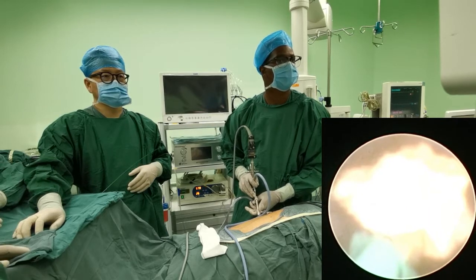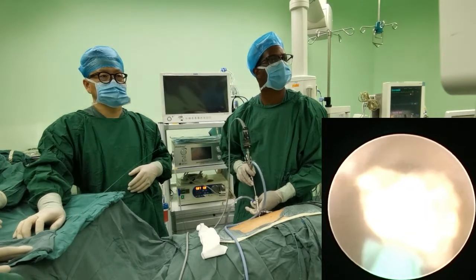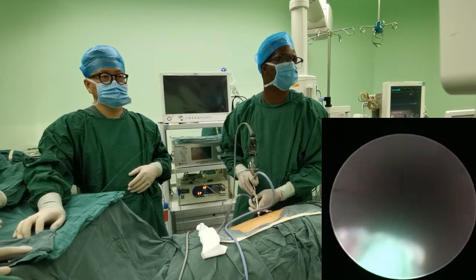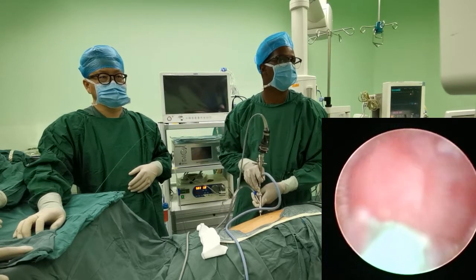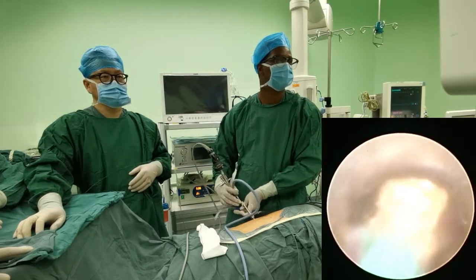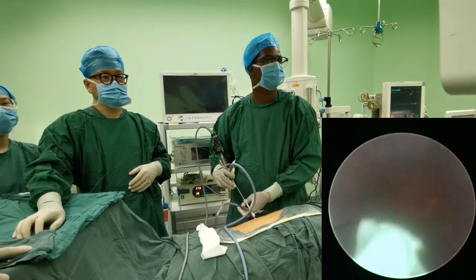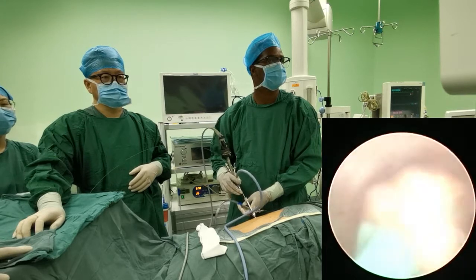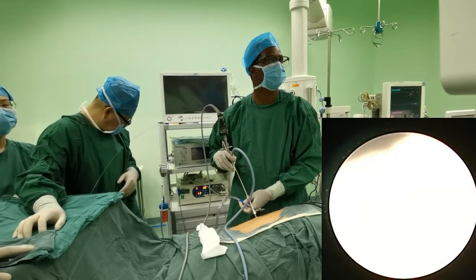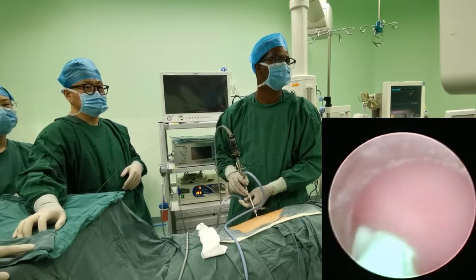Do you always use the laser with this device? Not always — sometimes in hospitals where laser is not available, you can use pneumatic lithotripsy with small probes, because the nephroscope working channel accommodates small pneumatic probes as well.